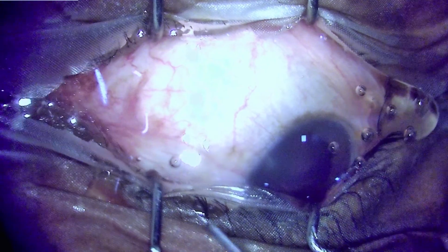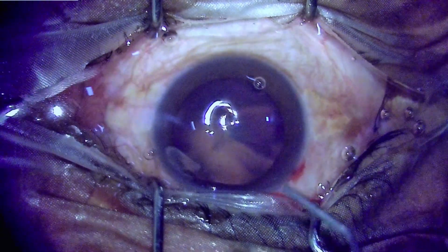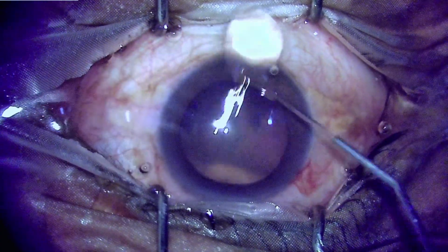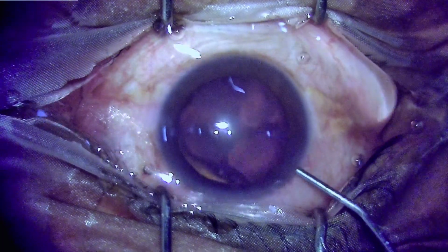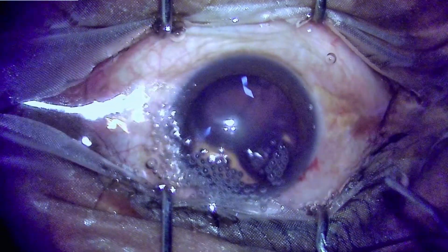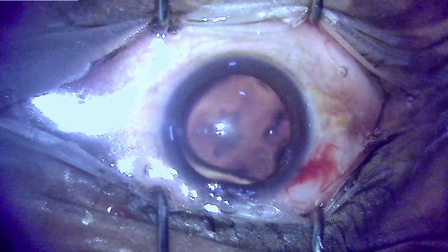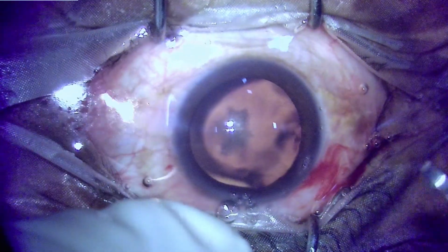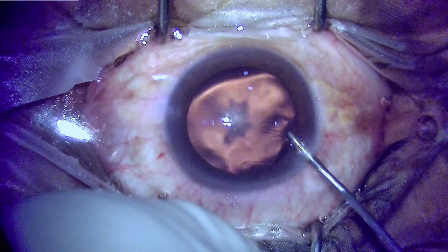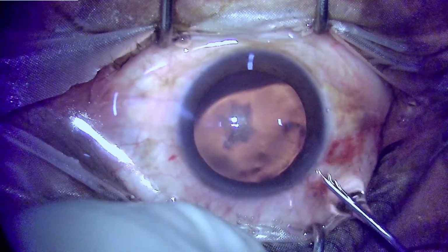Some supplementation of the topical anesthetic jelly just to make the patient a little comfortable, but still, as we can see, the patient has a significant amount of guarding reflex. So we have made the corneal incision and we are proceeding to inject intracameral lignocaine, which will make the rest of the procedure painless. The patient has been urged to look at the light, which is very dim now, and the patient is able to cooperate well, and we'll proceed for phacoemulsification.